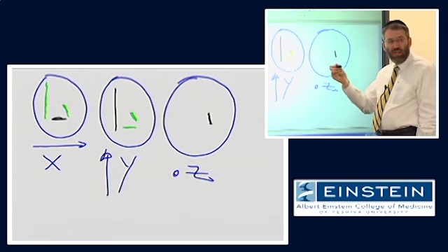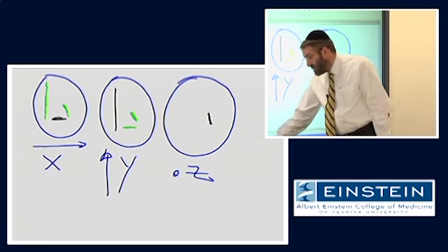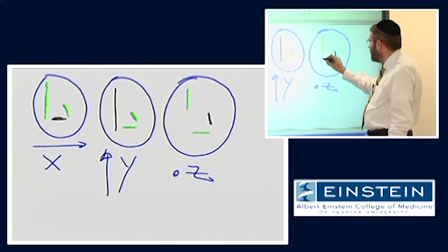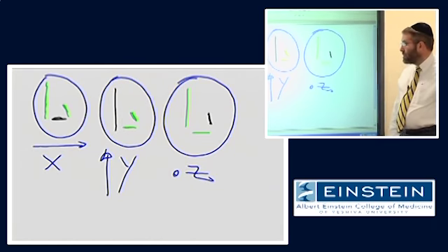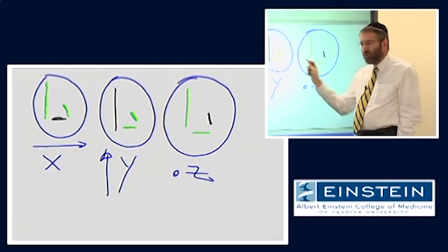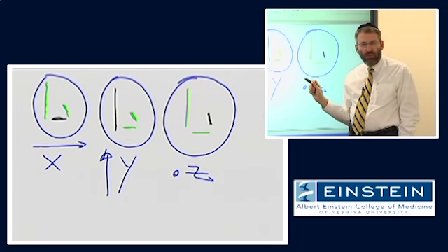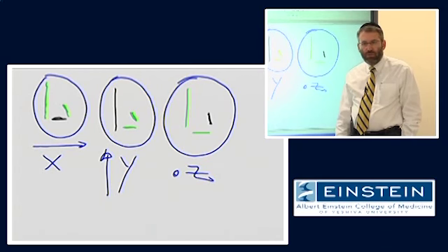The diffusion going in and out of the slice would be most attenuated because that's the direction that we're sensitizing, whereas the other two structures that we're looking at would have relatively high signal. So I think you can see that there is a pattern across these three different images for each location based on the three-dimensional trajectory of diffusion.